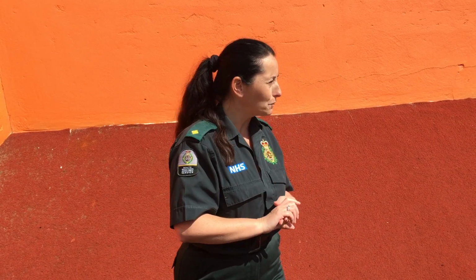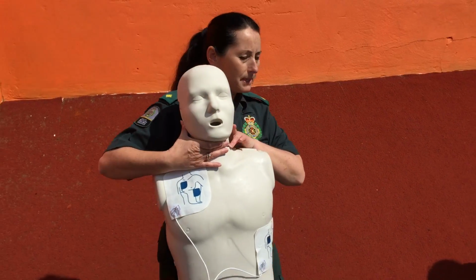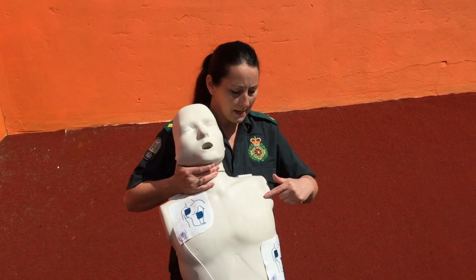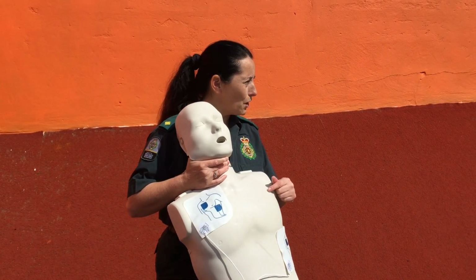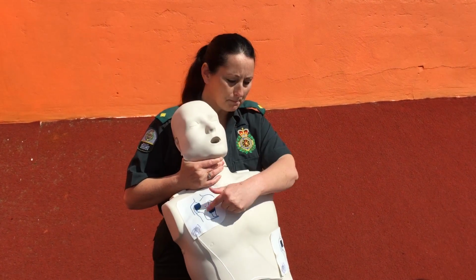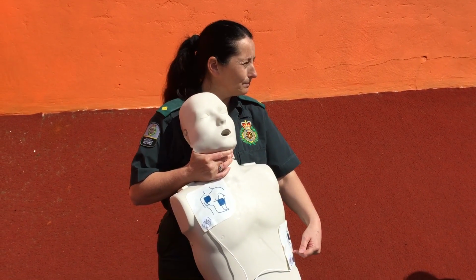I know it's a lot. You're thinking, oh, I'm never going to remember 8 Ps, but you will do once you've cut those clothes off and you see piercings. A pacemaker on somebody is normally over here under the left clavicle. As long as the pads aren't over the top, it's fine. But these pads are this way, so it's not going to be over the top of the pacemaker.